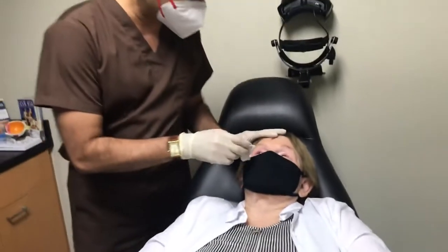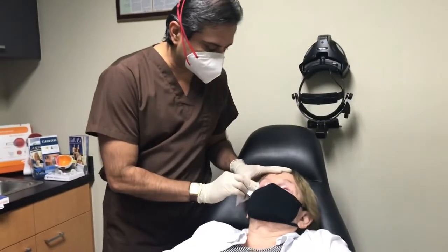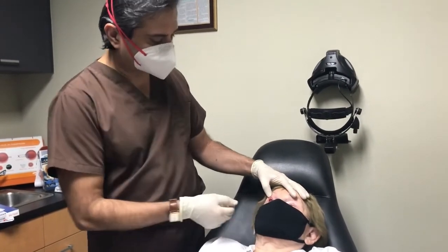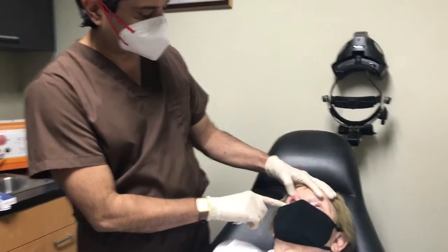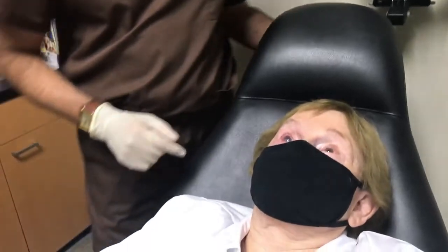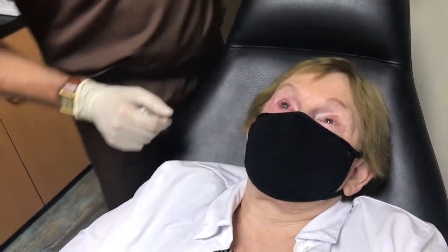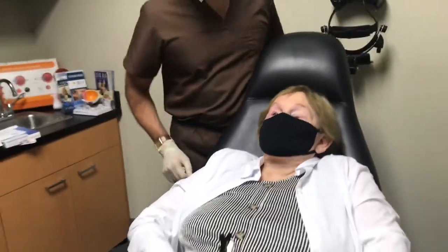Close your eyes, Linda. Open, please. I just love the placenta — look at her eye glistening already. Now we'll do an image on her. You comfortable, Linda? Mm-hmm. Super. Good to go.